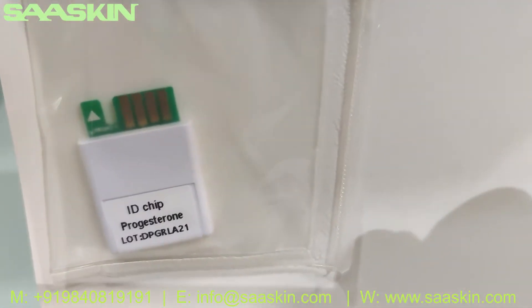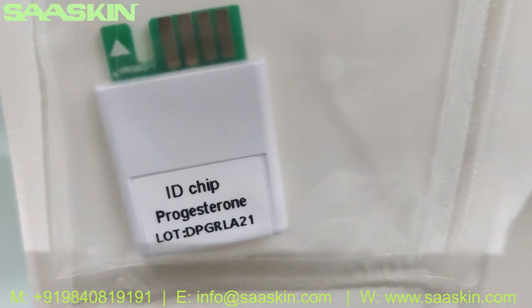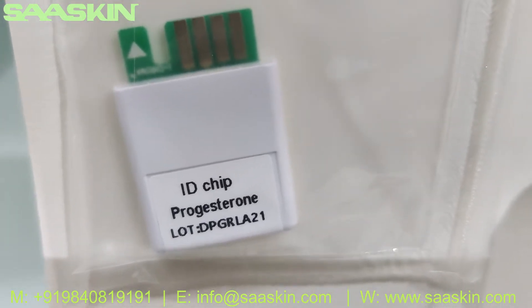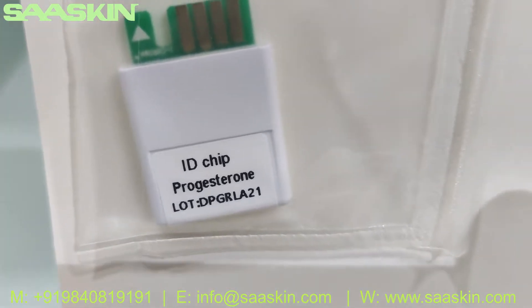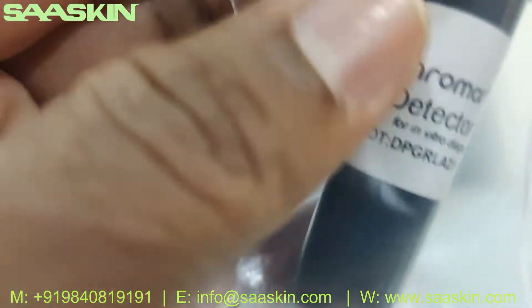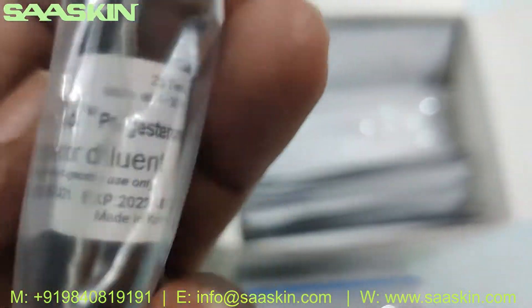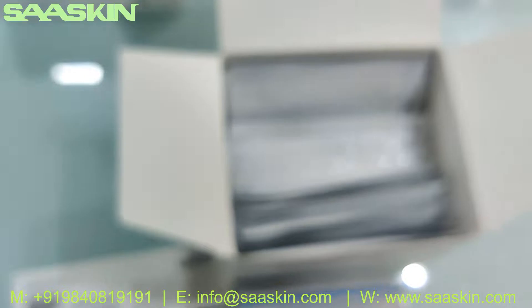You've got an ID chip — one ID chip that comes in the box. And you've got a buffer liquid here, the diluent buffer. And the iCHROMA2 detector diluent buffer liquid.